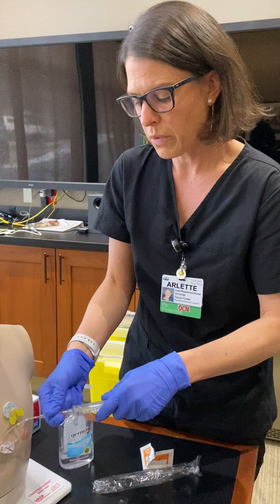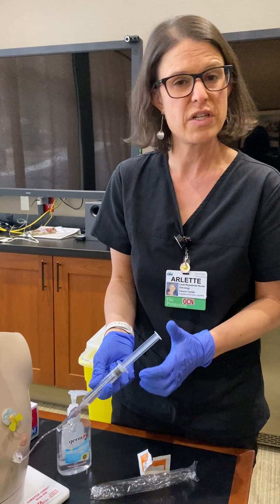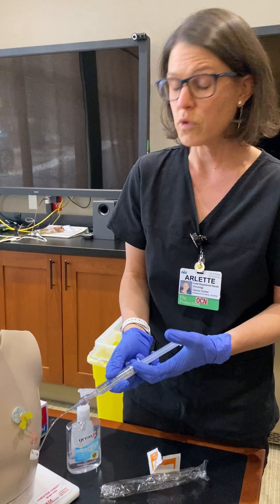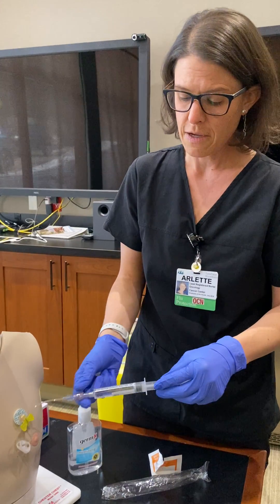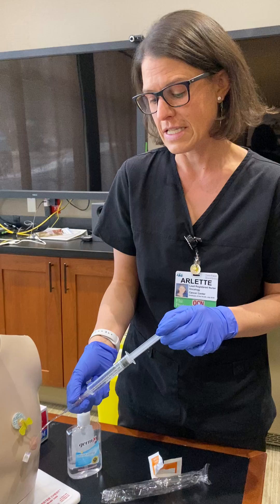Moving forward, we no longer are going to need heparin when deaccessing lines. Saline has been shown by INS and ONS to be effective, so heparin will no longer be a part of our order sets. What's more important is the actual technique that the nurse uses to deaccess.